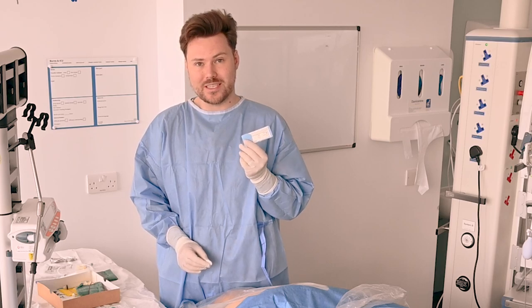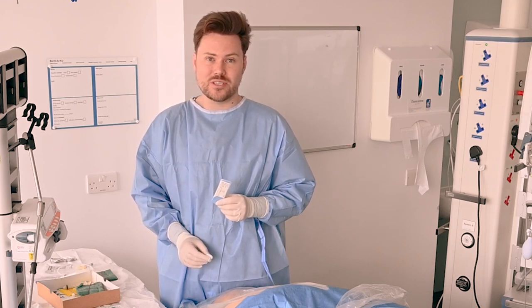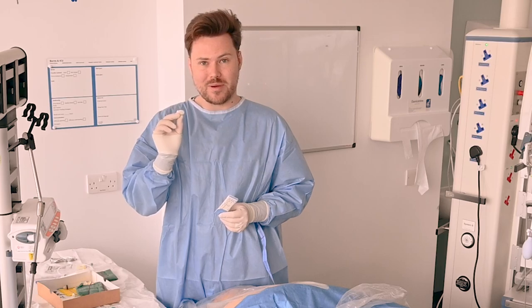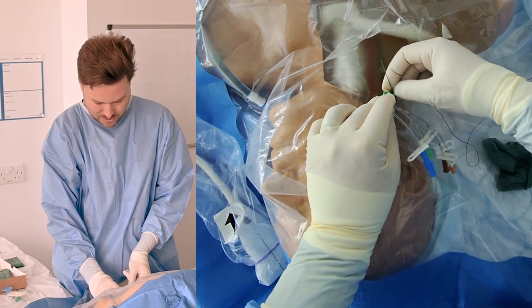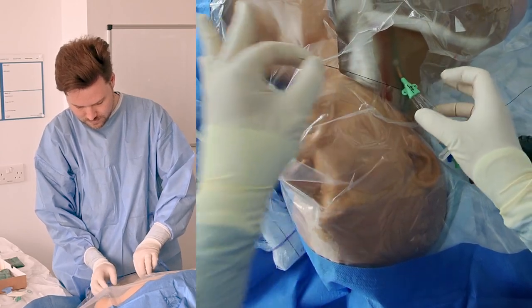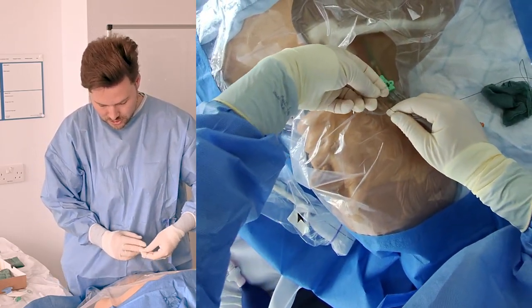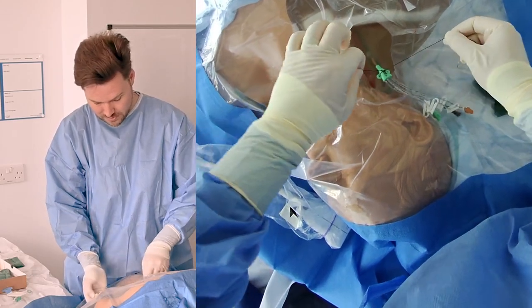Now let's move on to suturing. In this demonstration I'm going to be using a 2.0 silk straight needle. You should use what you're most comfortable with, and if you haven't yet learned to suture it's worth practising that before you start your central lines — I suggest using a suture kit with a curved needle for safety. We also have a biopatch; I tend to insert these after the line has been sutured, because the small amount of bleeding you can get can end up causing some blood to go on the biopatch. The technique I use is to insert one end of the needle back through the hub, across the skin, in one large bite of tissue, carefully picking up the needle on the other side, and then inserting it again through the opposite side of the central line hub. I can then tie a surgical knot to secure the central line in place. If you don't know how to hand tie, you can use instrument tying, ideally with a curved needle.